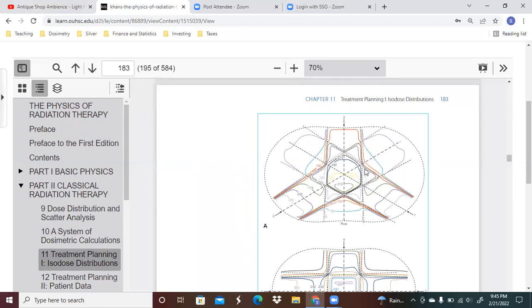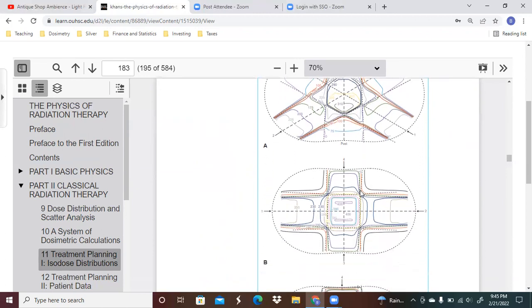So you might end up seeing a dose distribution like that where you've got exit dose here, but you got a lot of entry dose from both of these creating a hot spot here. And then you might have a lower level isodose line here, still fairly hot. Then you have one that goes out and encompasses most of the other volume over here.